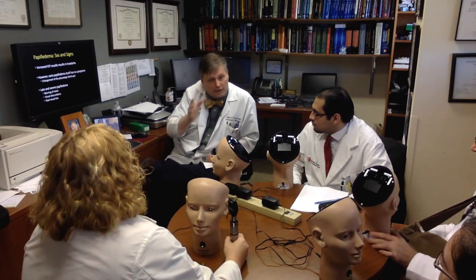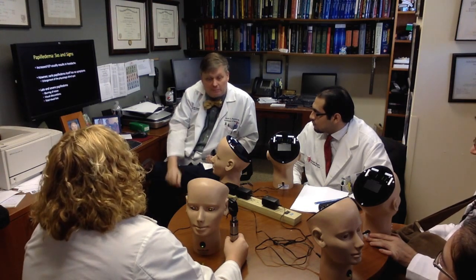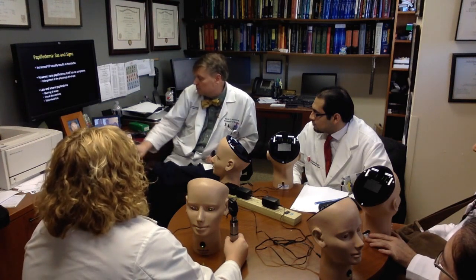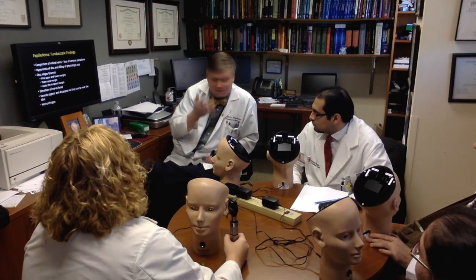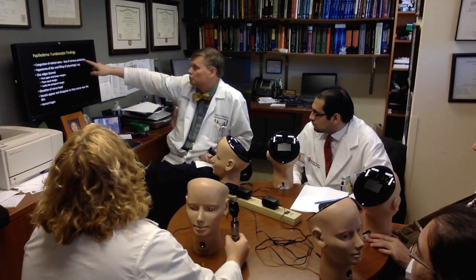Now, if someone has chronic papilledema, yes, it can damage the optic nerve. But acute papilledema, most of the time they won't have any visual symptoms. They might have symptoms of their intracranial pressure, though, like headache or nausea and vomiting. So what do you see? The retinal veins are congested and tortuous.